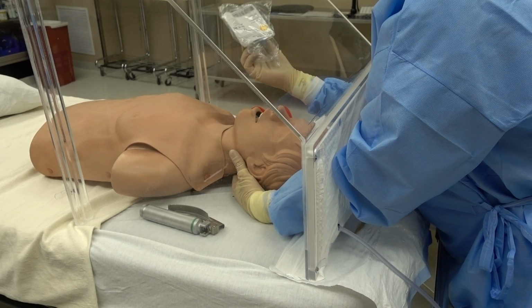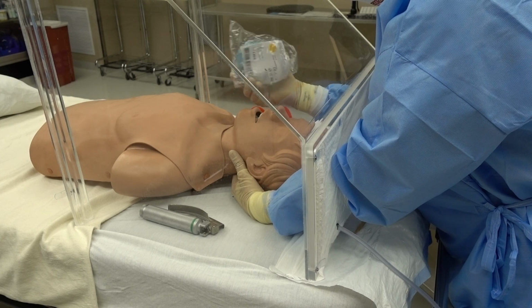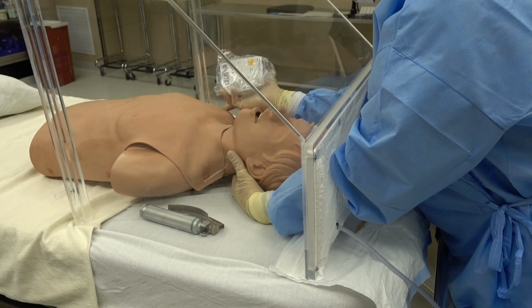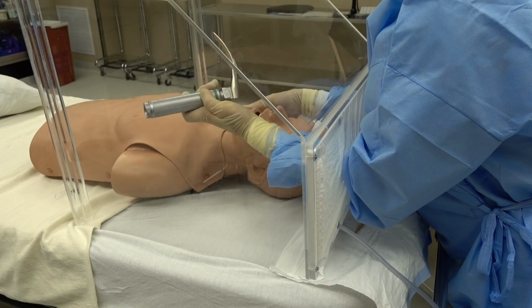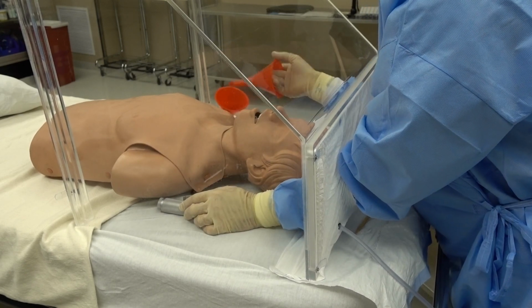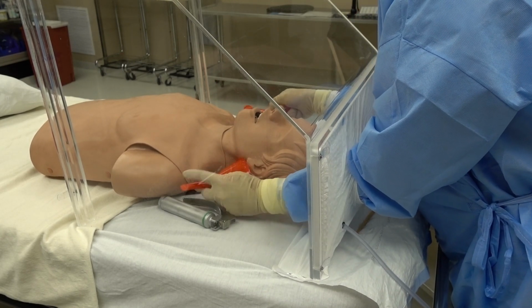Your assistant, well, I forgot to put the bag on the other side. I'll show you that in a minute. But anyway, those are going to come in the OR with that bag on the back and this one on the front, more than likely. And these will probably even be punched for each anesthesiologist. But you can bag in here. You can have your assistant reach through the bottom of that and bag. You can easily get great visualization. You don't have to have a video scope. When you come out, you can put the circuit, you can put the unit through here too, wherever you want, and it will seal.